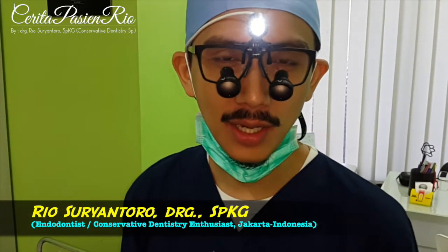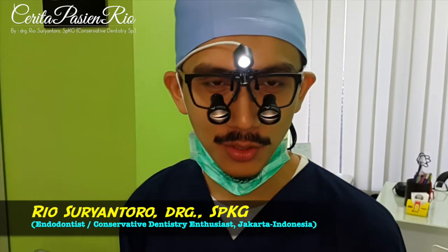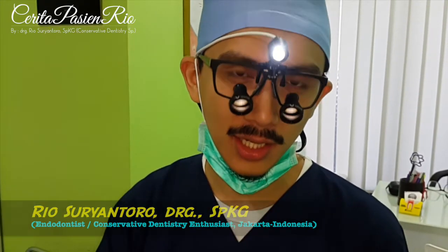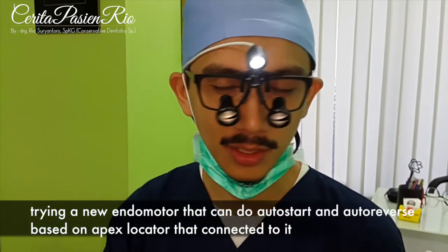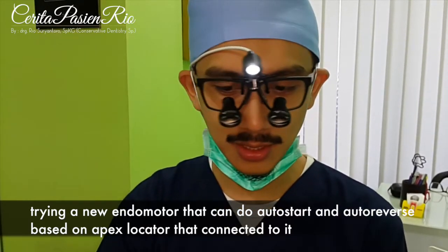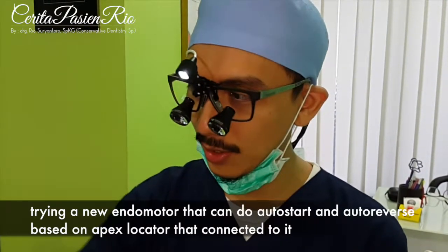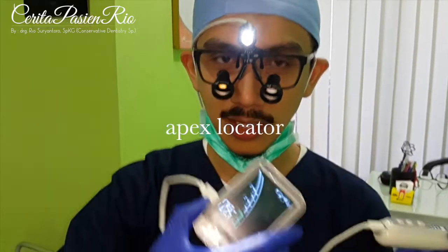Good morning, my name is Rio, I'm an endodontist from Jakarta. Today I'd like to try the new endomotor that can do the auto start and auto reverse according to the apex locator attached to it. The endomotor is here and the apex locator is located on my desk on my unit.